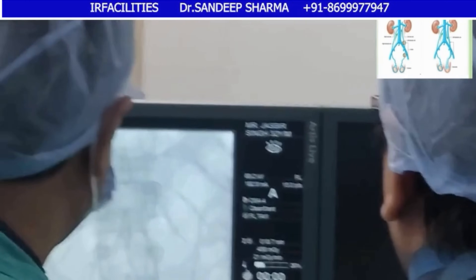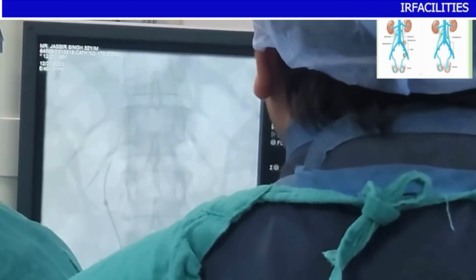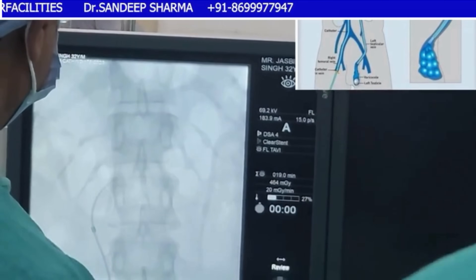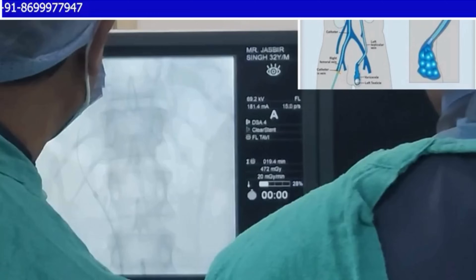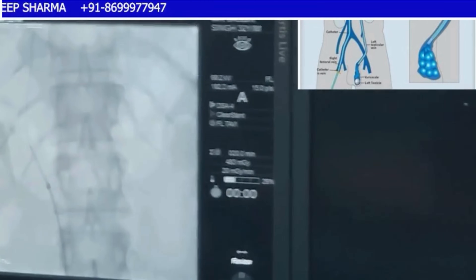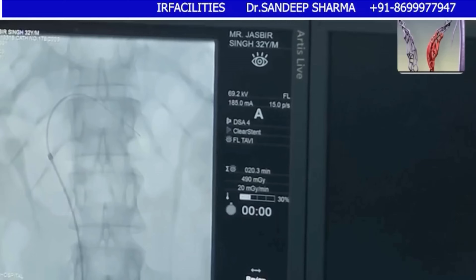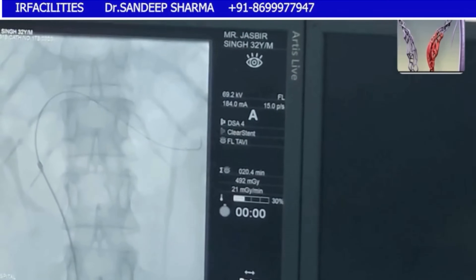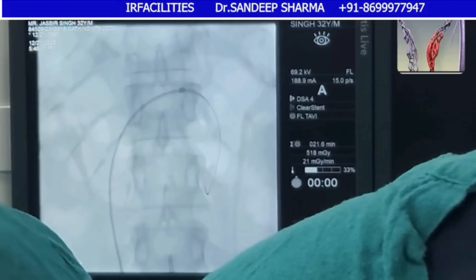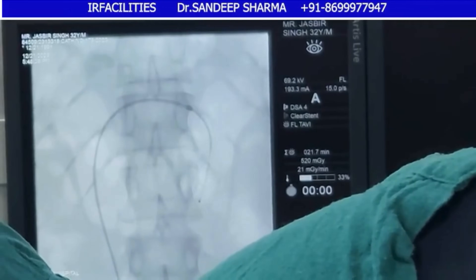I have already obtained puncture of the right femoral vein and with my sheath and RC2 I am ready to hook the left renal vein for the left testicular veins. As I pass my wire there is some tendency to go towards the right, but I give it a little torque and push to get it into the left renal vein. It's a little difficult but I rotate it towards the left - it has a tendency to jump out - and then I turn it towards the renal vein and I'm in. First easy hooking, but as soon as I hook I find there is no way downwards and it is going upwards.